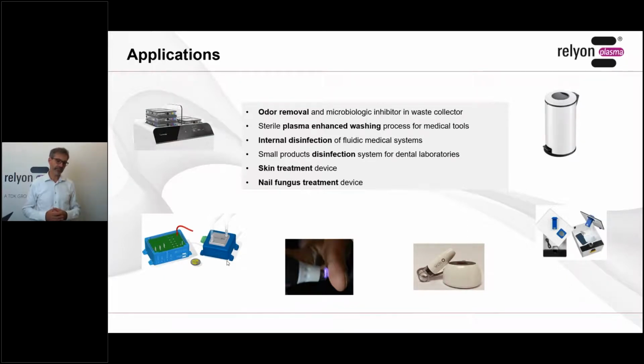wet environment, and I run the plasma under wet conditions, and I can make all the walls be below dew point, we will see the formation of a highly aggressive, corrosive, and also biocidal film very quickly that can be very efficient in removing some of these microorganisms. So it is often a very good idea to combine humidity with plasma.